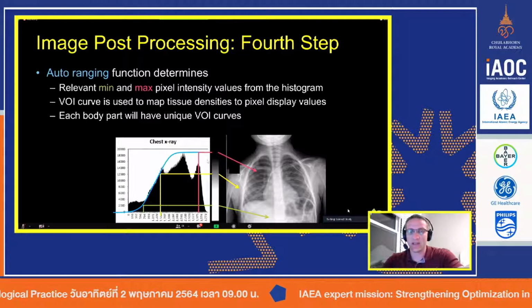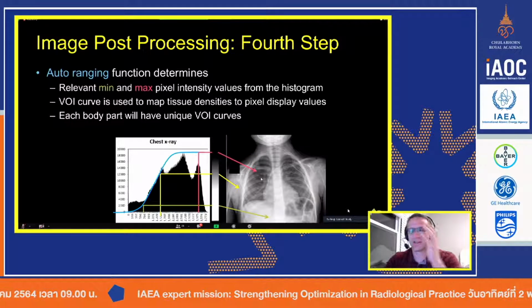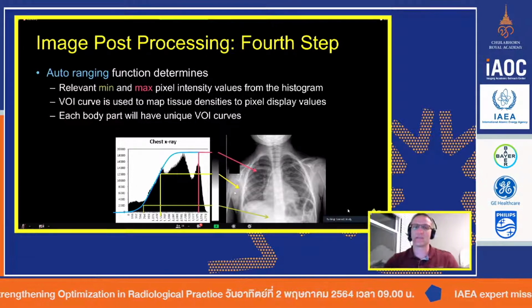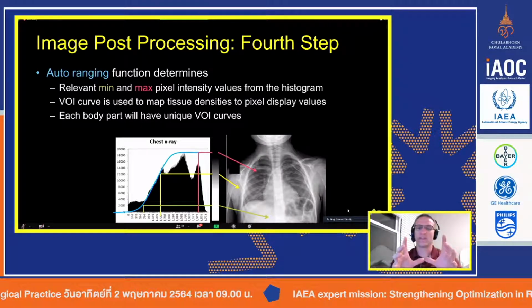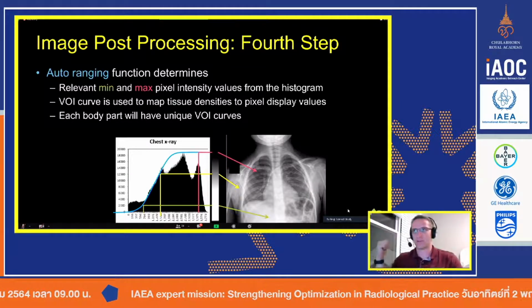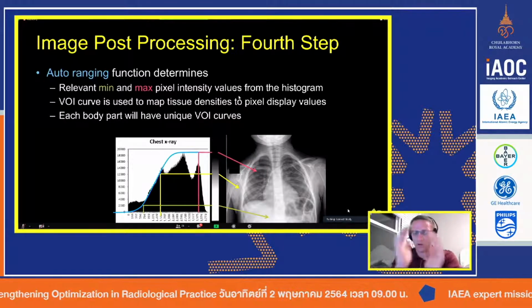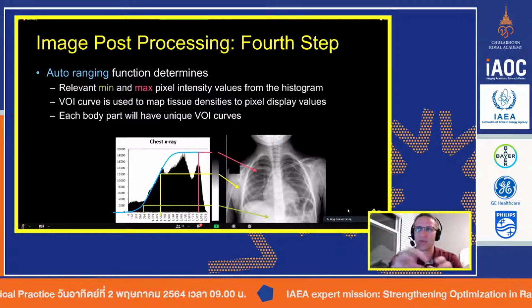And that is why it will come across, and the grayscales that you're normally used to in, say, a chest radiograph, or the white that you see in the bony anatomy for a skull, they will be just off. Some people, if they just don't want to take the time to collimate, will use one big field of view, acquire the image, send the patient out, and then electronically collimate it. So the radiologist will see the image with proper collimation and think it was acquired that way. But the image itself, the grayscale, will be a little off.